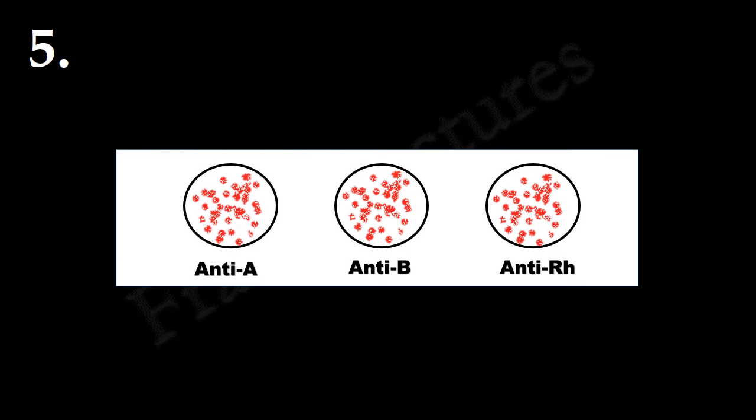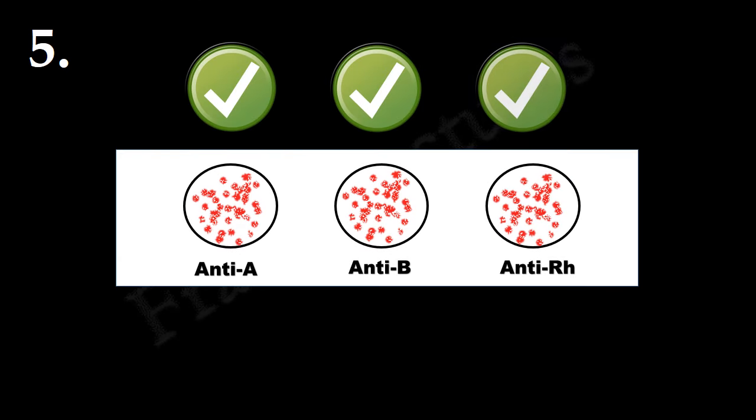Here, agglutination is observed in all three circles. This means all three antigens are present. Therefore, blood group is AB positive.